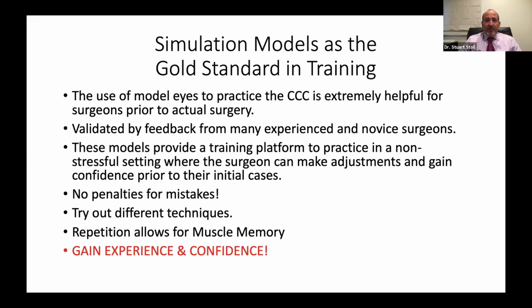So I believe that simulation models are becoming the gold standard in training. And especially for CCC, it's extremely helpful for surgeons before their actual first surgery. This has been validated by feedback that I've gotten from many years working with experienced and novice surgeons, that these models provide a training platform to practice in this non-stressful setting so you can make adjustments and gain confidence.